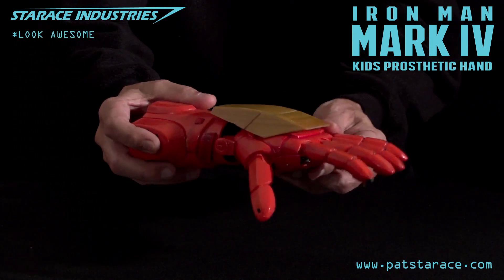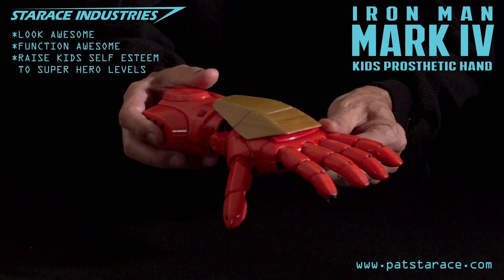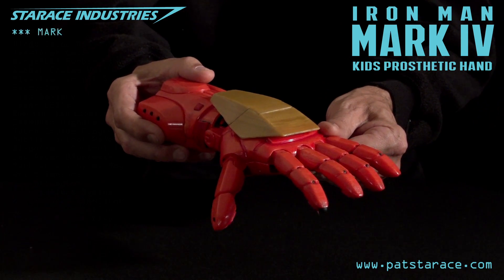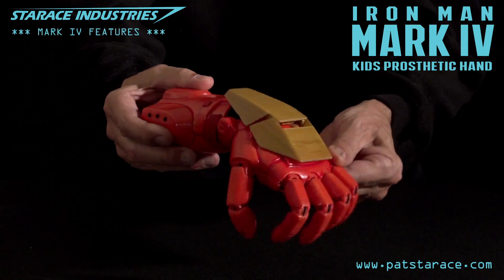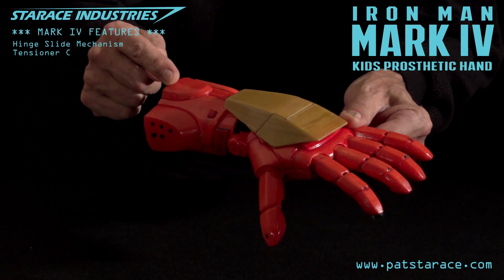The armor had to look awesome, function awesome, and raise kids' self-esteem to superhero levels. The Mark 4 includes all the functionality of the Mark 3, including the shield that houses the lasers with the hinge slide mechanism, and the cover that hides the tensioners.